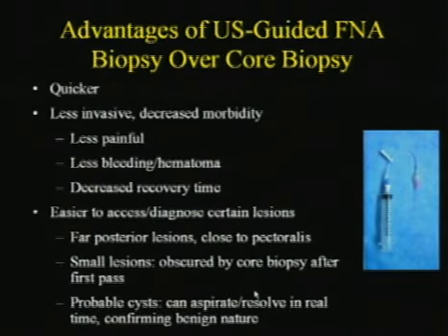The advantages of this type of biopsy are that it is often quicker than core biopsy. It is less invasive with decreased morbidity. In general, less painful with less bleeding, decreased recovery time. Just in general, this is almost like a blood draw. Patients do not experience much pain with this type of procedure. Also, for certain lesions, they can definitely be advantageous.